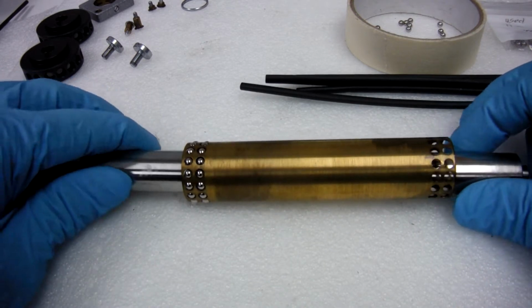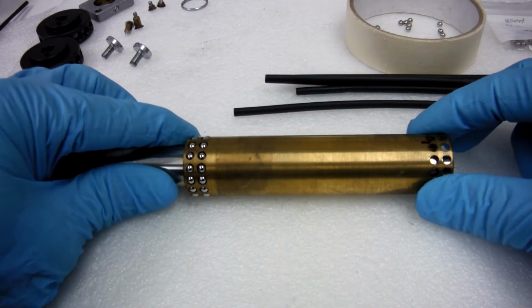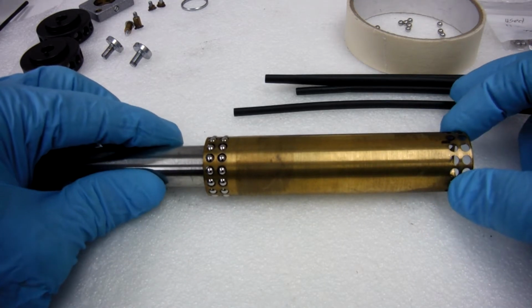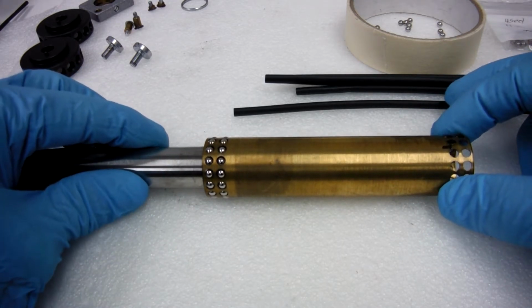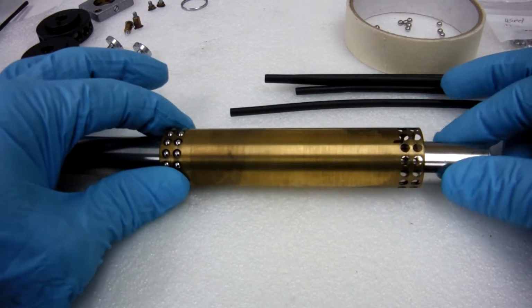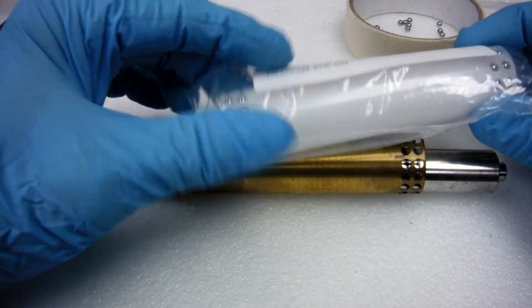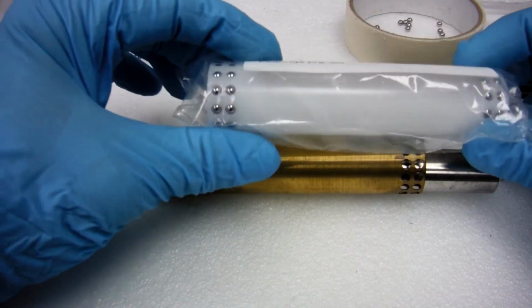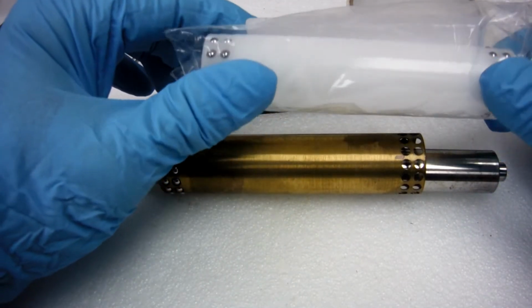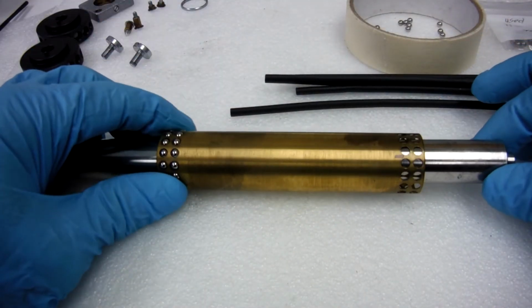This is a Haag-Streit axle with bearings. The bearing track went too far past the axle, so we lost bearings. So I'm going to have to try to put them back in. You can buy a pre-made roll of bearings for $100, or you can put them back in.